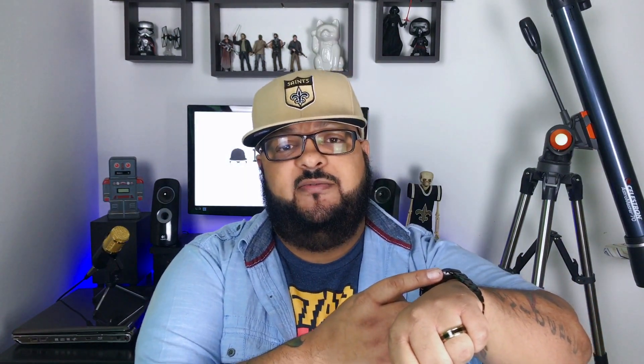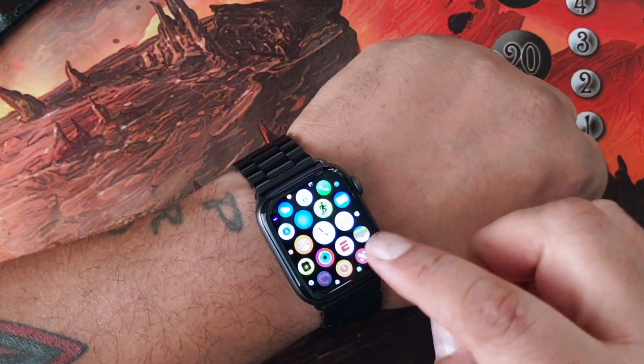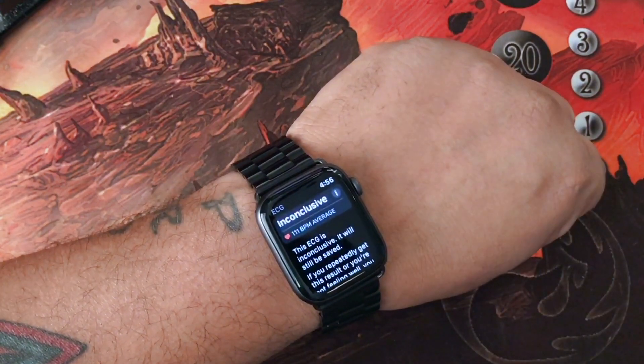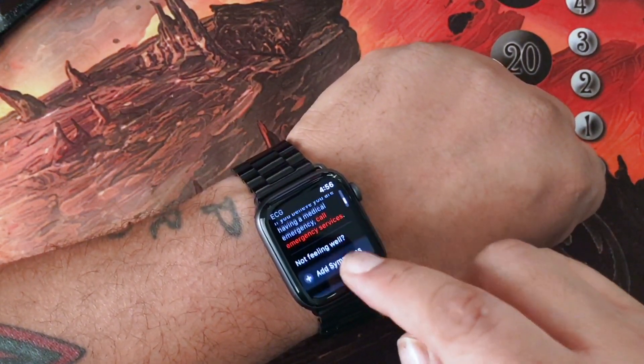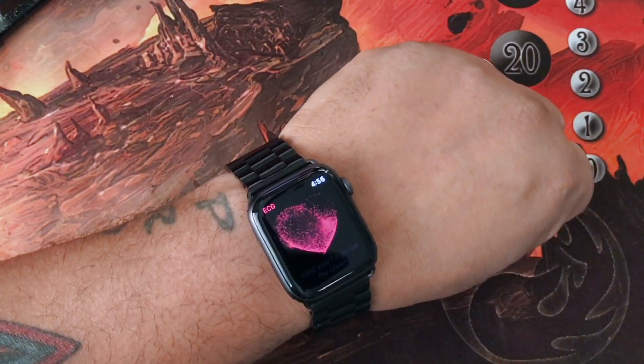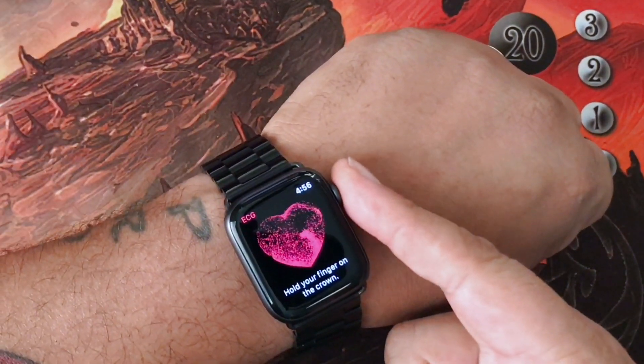Turn on the watch, find the app, and tap it. Dismiss anything that's in there. Then when the heart graphic comes up, go ahead and put your finger on the crown.